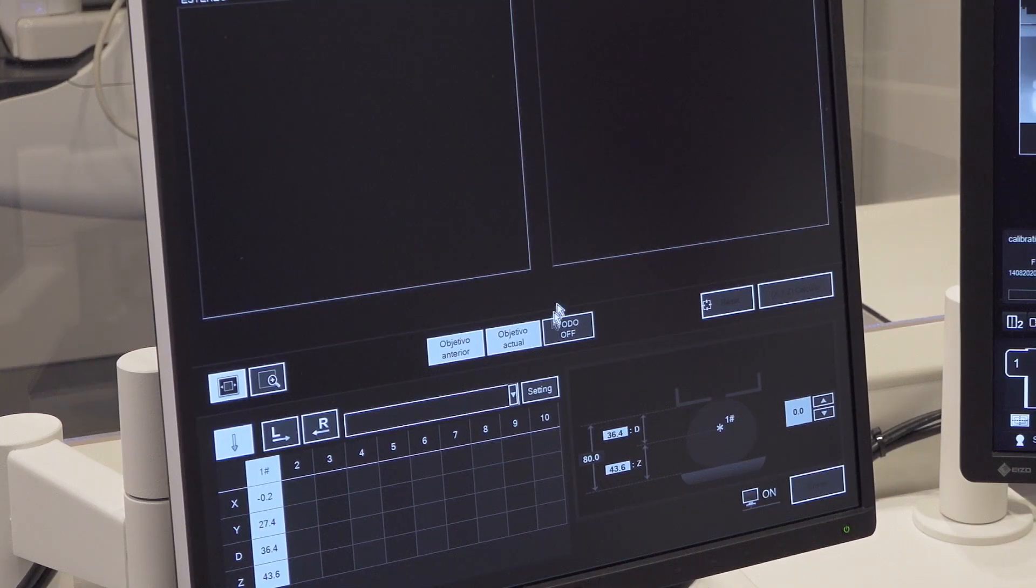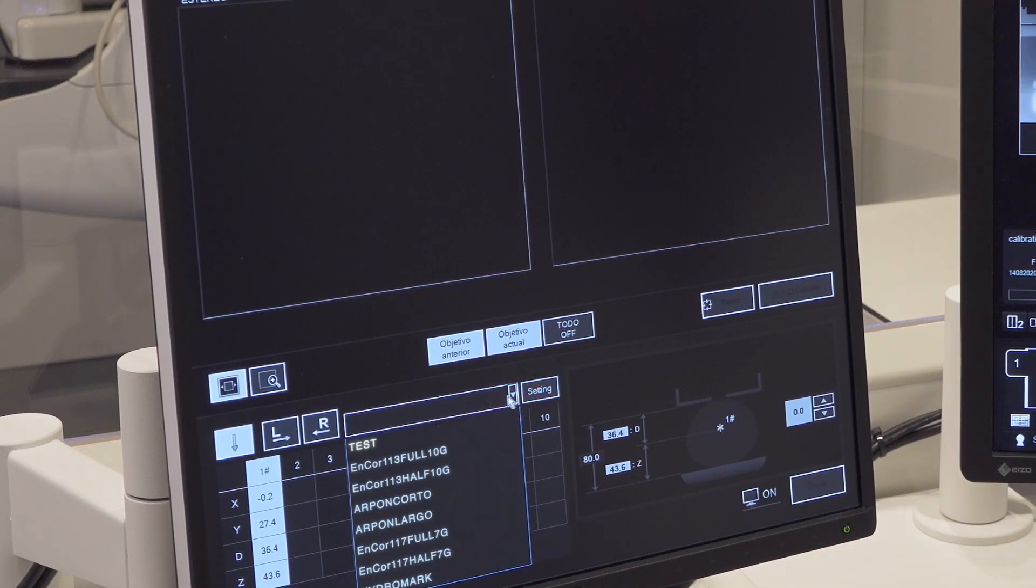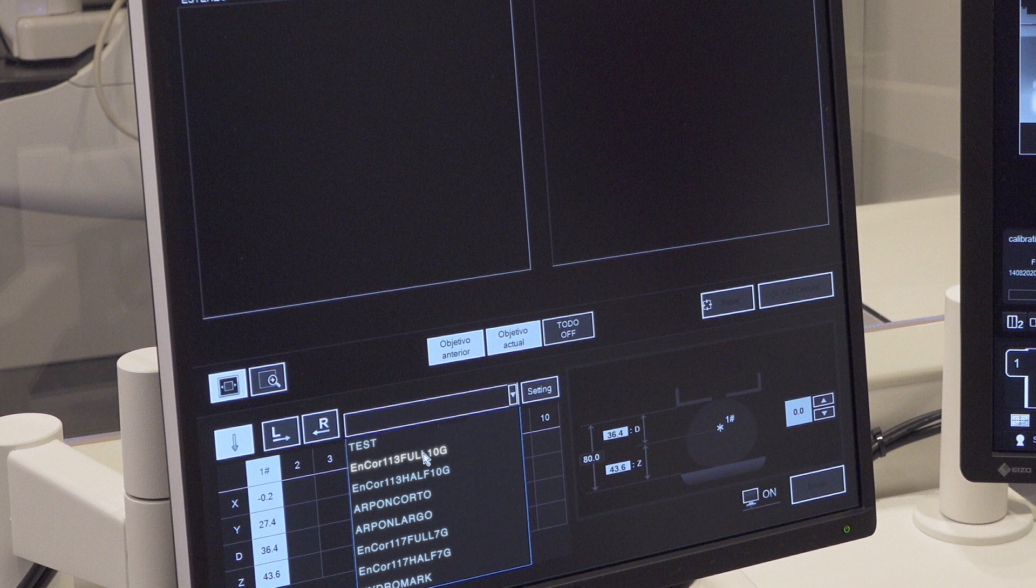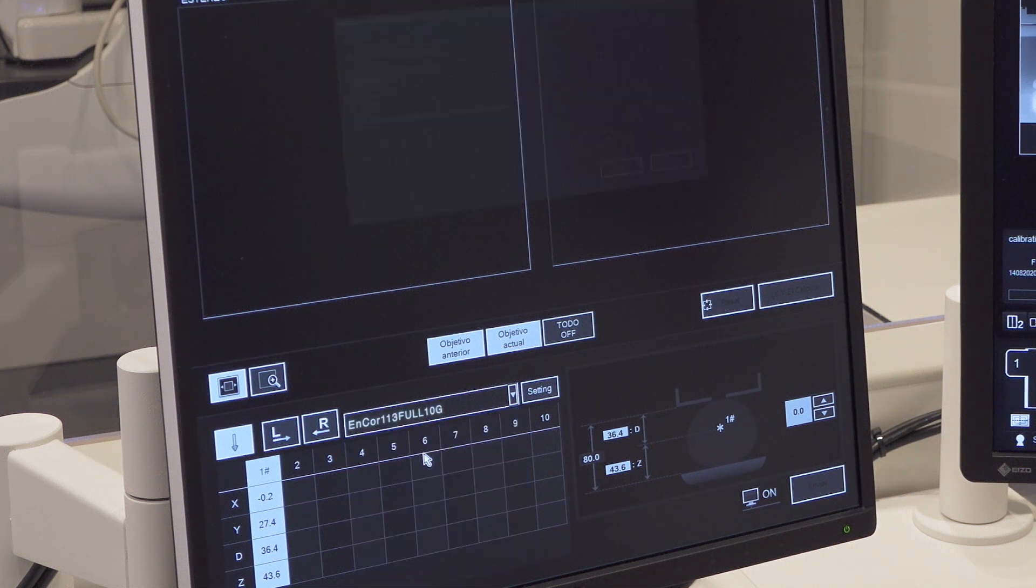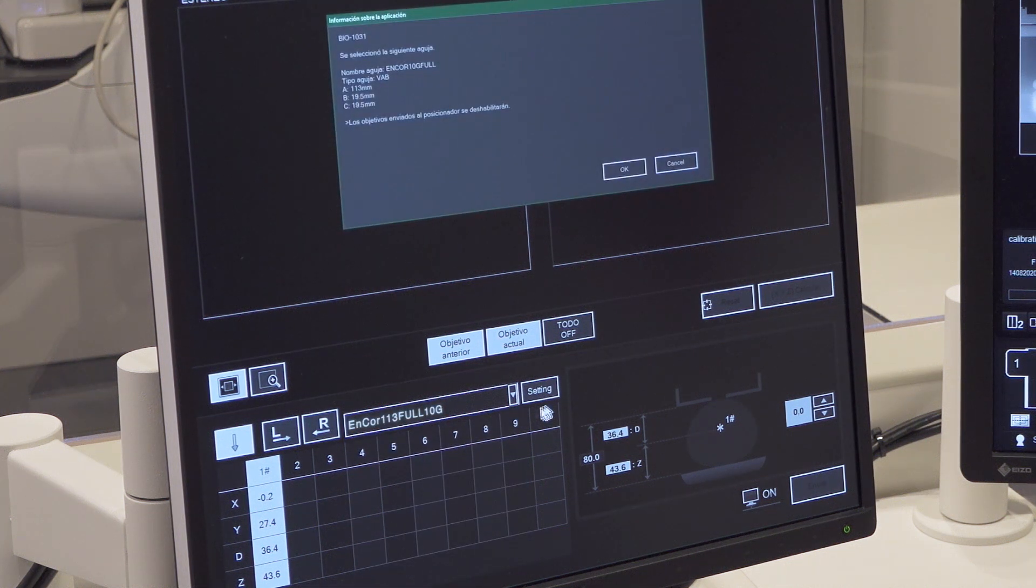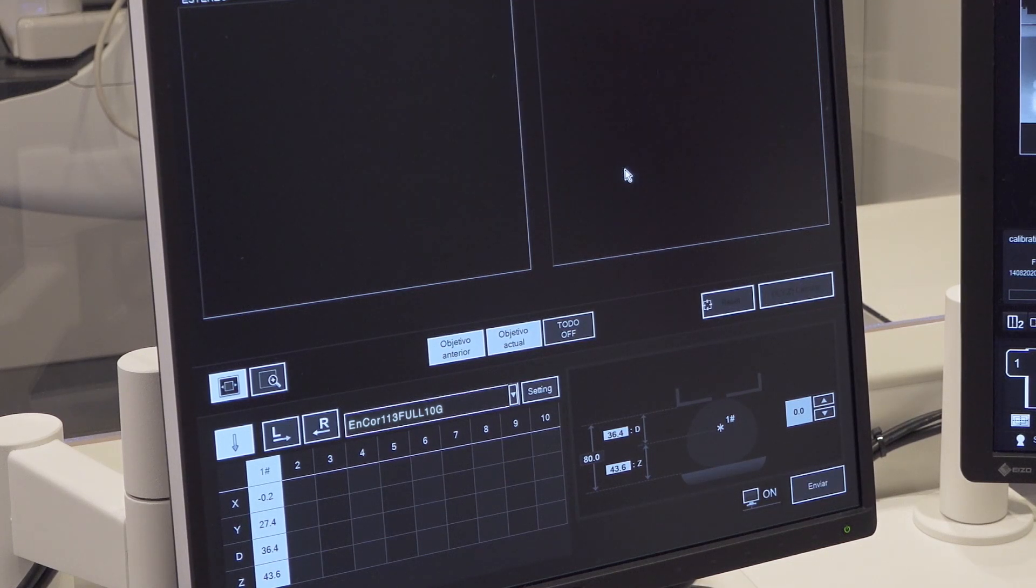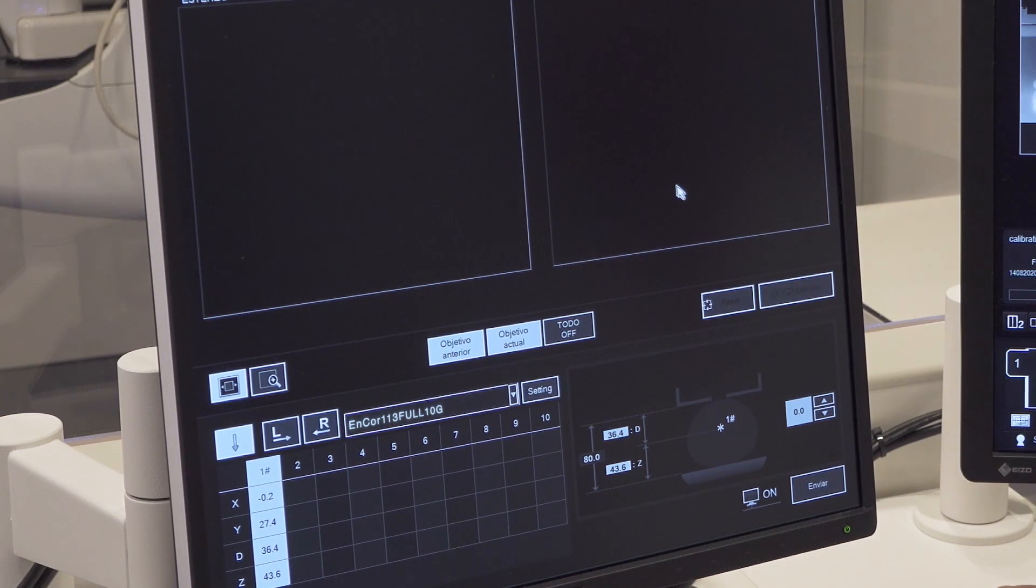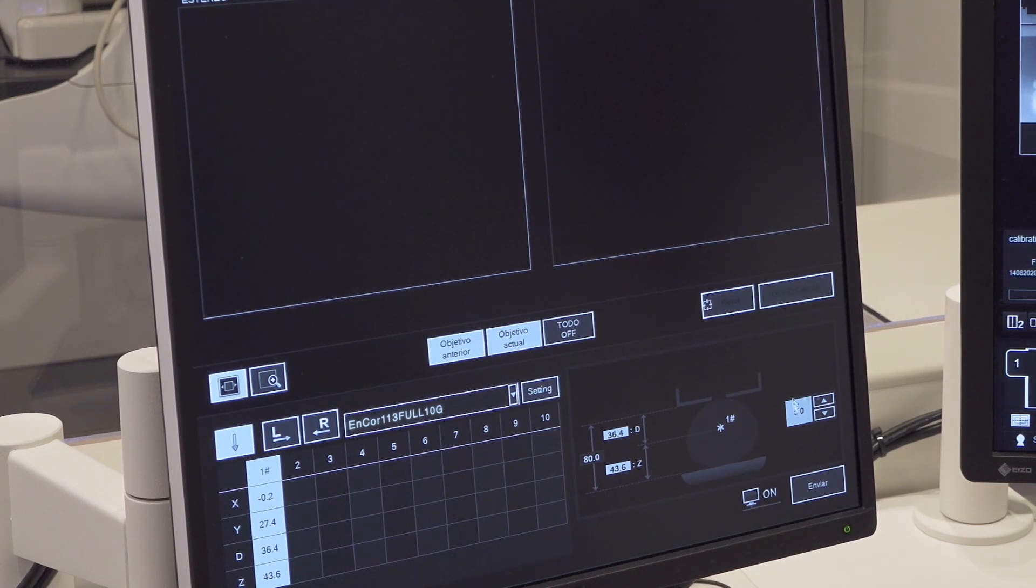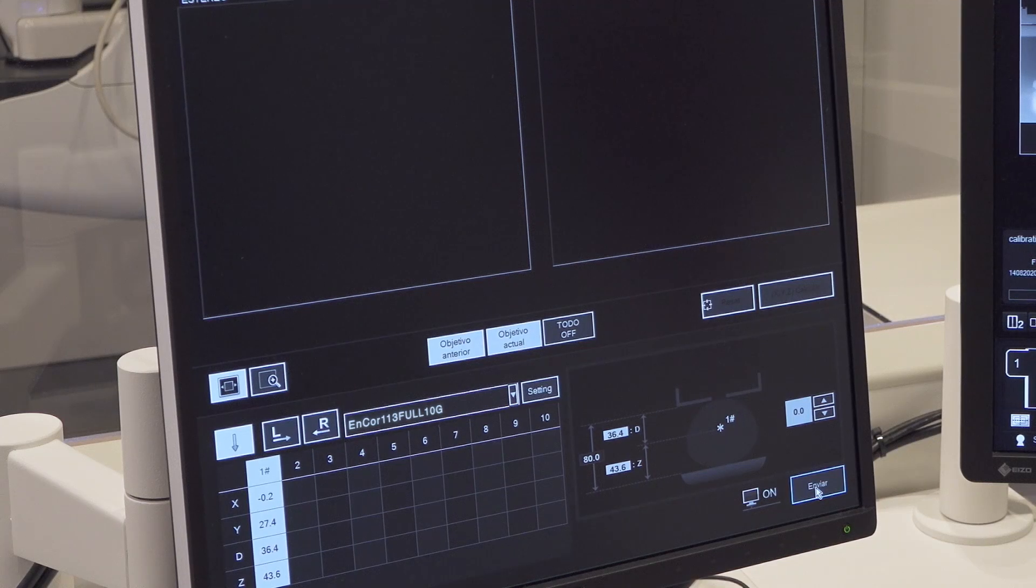Open the needle drop down menu and select the Encore 113 full 10G needle. Confirm selected needle values. Click the Send button to send coordinates and needle characteristics to the biopsy positioner.